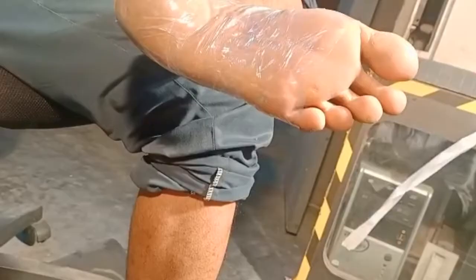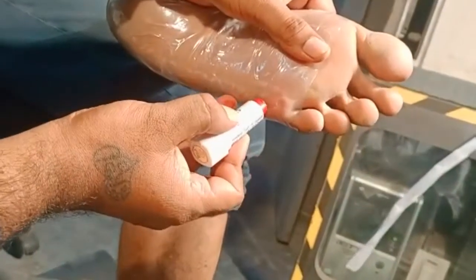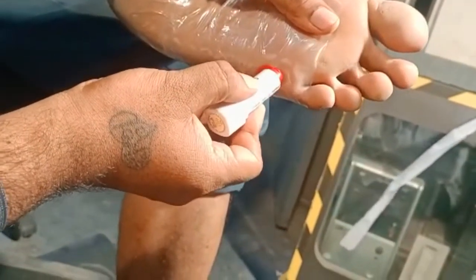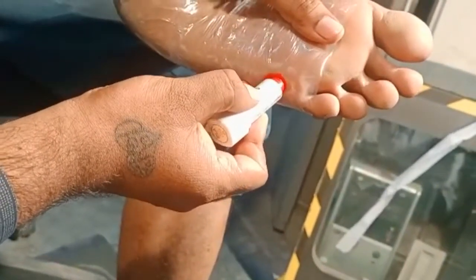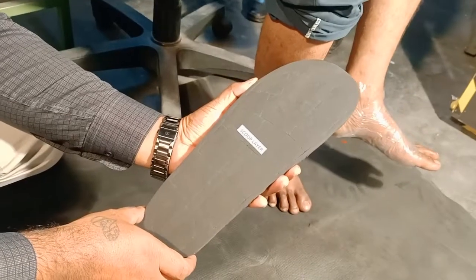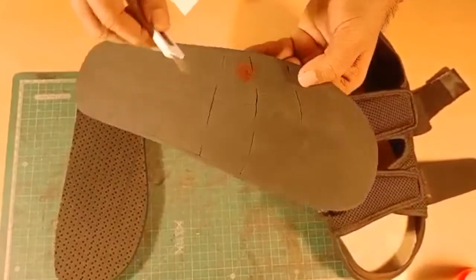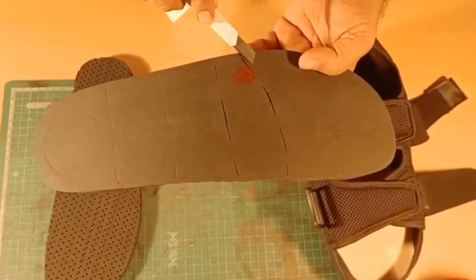First, we apply a clear wrap, use a lipstick and mark the area which requires offloading — this can be a callus or an ulcer. Now we place the scooping layer below the patient's foot and transfer the lipstick mark onto it.